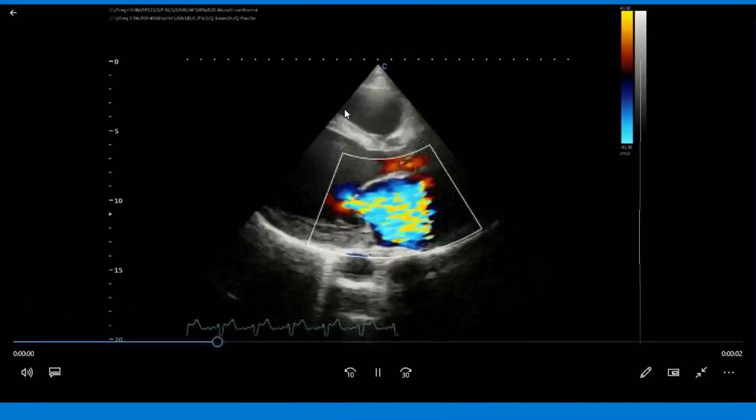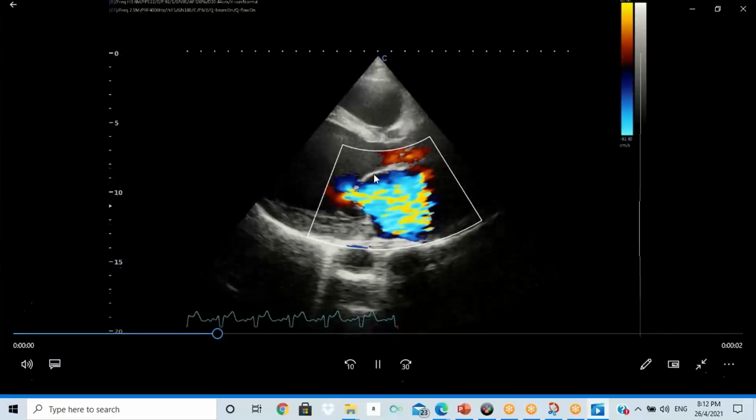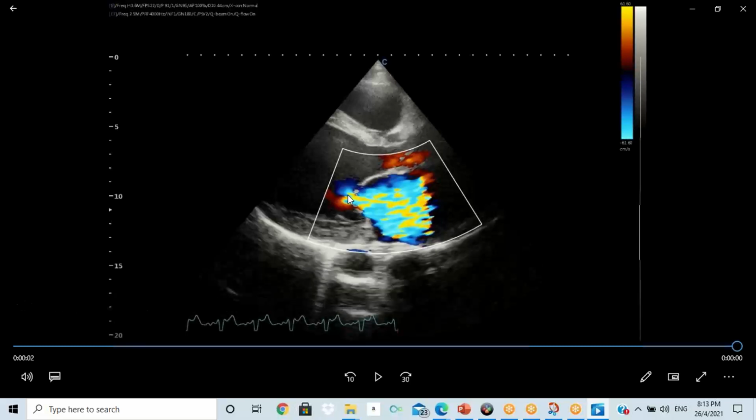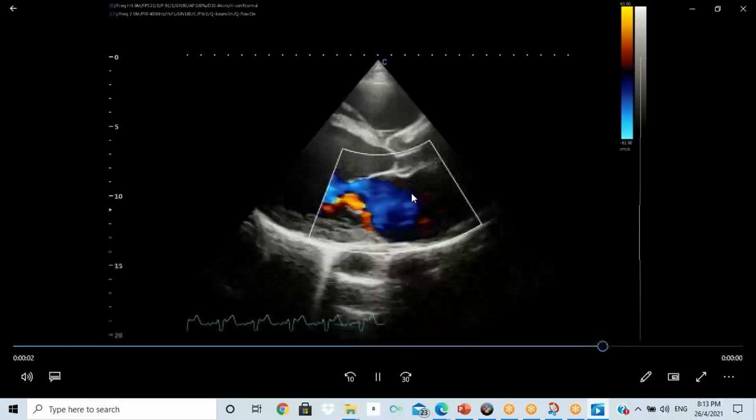And okay, so the color is across the mitral valve, and we see this mosaic, probably mainly bluish color. Again, your transducer is here. So if this is blue, the flow is moving away from the transducer, really. So it's a flow coming from the left ventricle across the mitral valve, and it's going into the left atrium. So this looks huge. So the area of this looks huge. So even if you don't know how to quantify mitral regurgitation, this looks huge. And the first instinct is that's large, and then you wouldn't be incorrect, because this is significant mitral regurgitation.